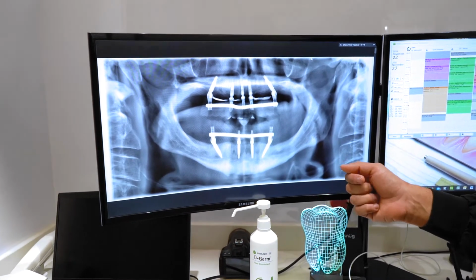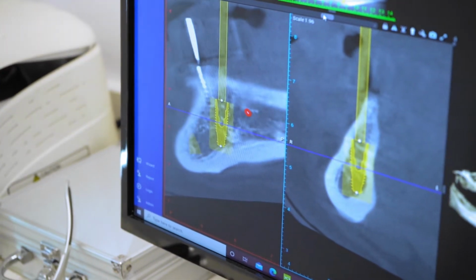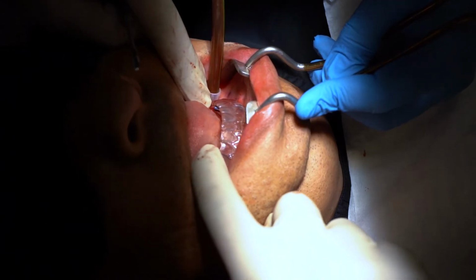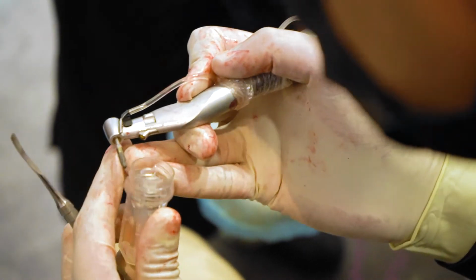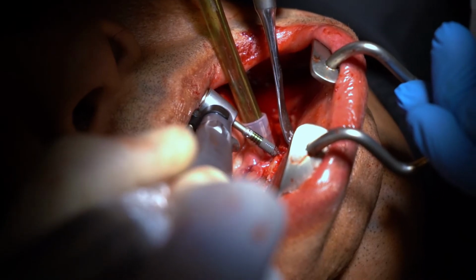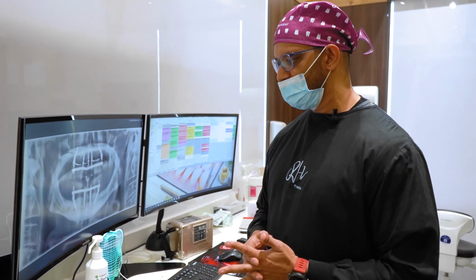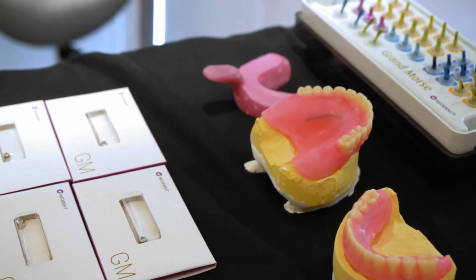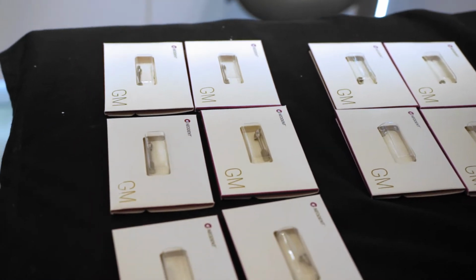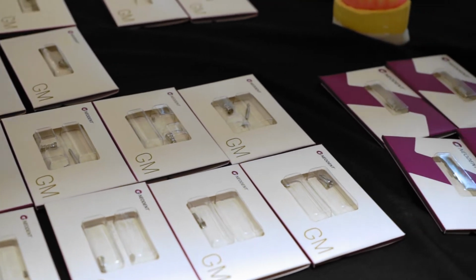In the lower jaw specifically, the consequence for future implant work is that there's a nerve canal that runs in the mandible. It's called the inferior alveolar nerve. And if we wanted to place implants to restore this patient to a fixed rehabilitation, the height available of bone above the nerve to the crest of the bone doesn't allow a standard length implant to fit in there. And at times even a short implant doesn't fit in there. So what the surgeons do for us is, yes, the surgeons are cool, they place implants at angles. And with the 2 distal implants placed at angles, it allows them to engage the good bone in the anterior mandible where there's no nerve.